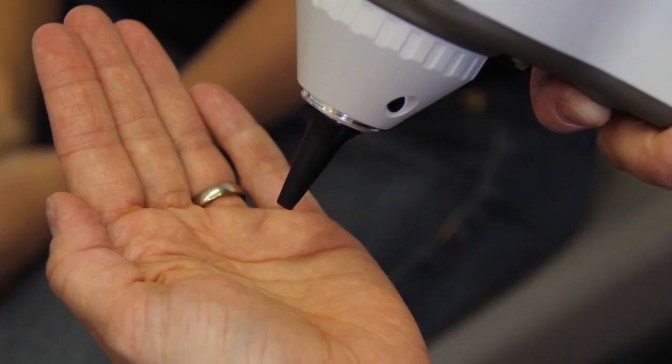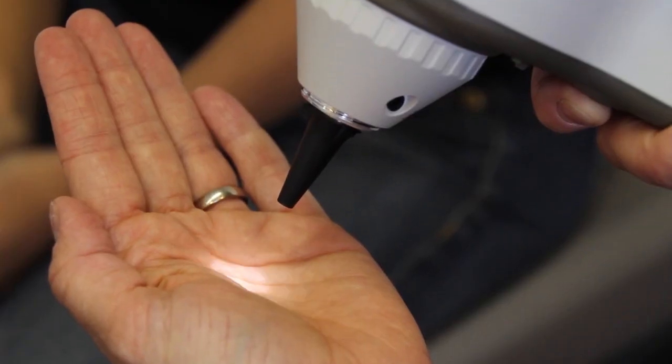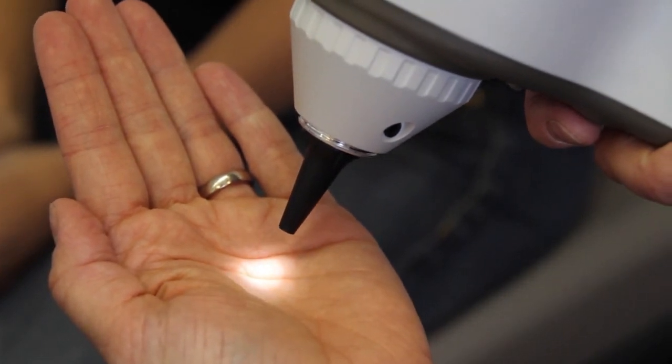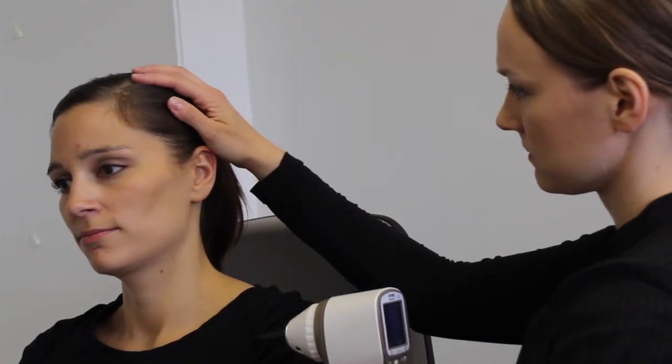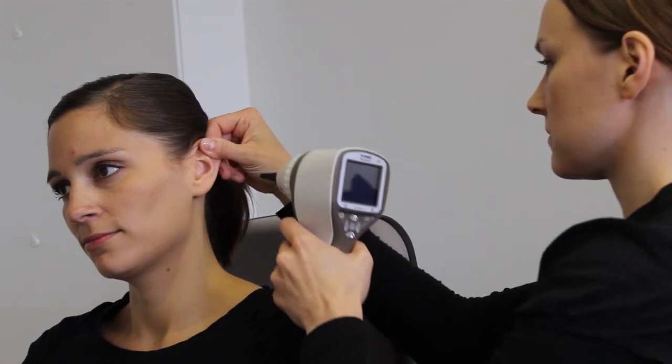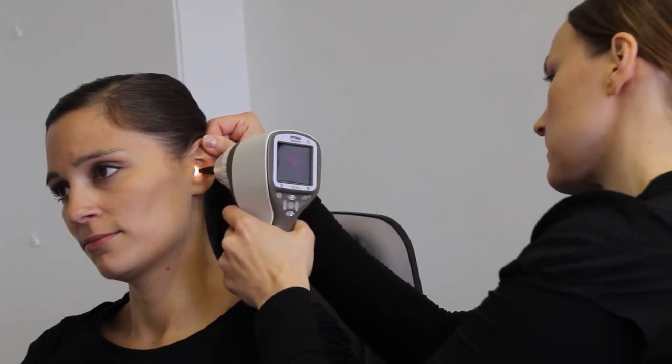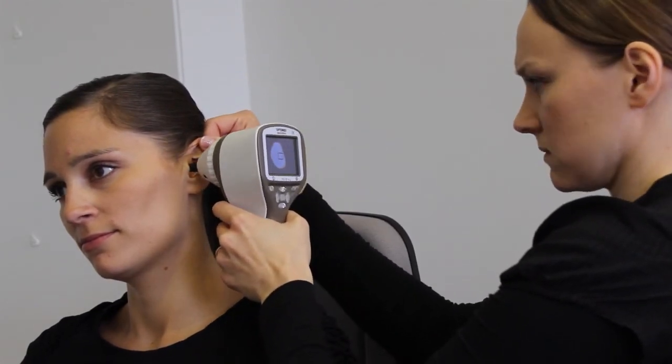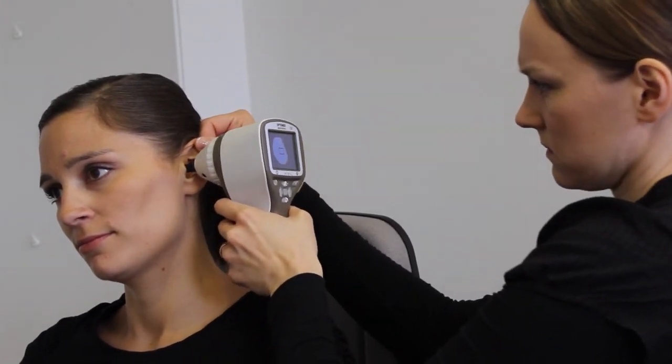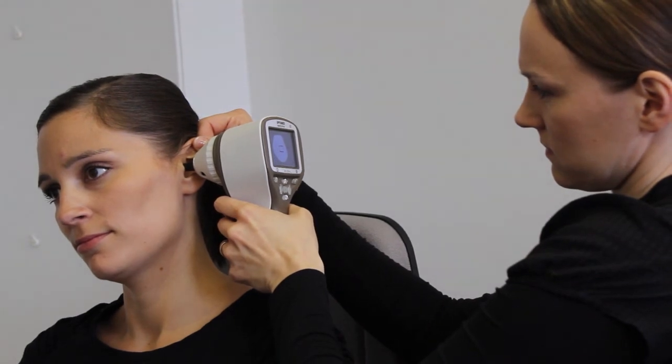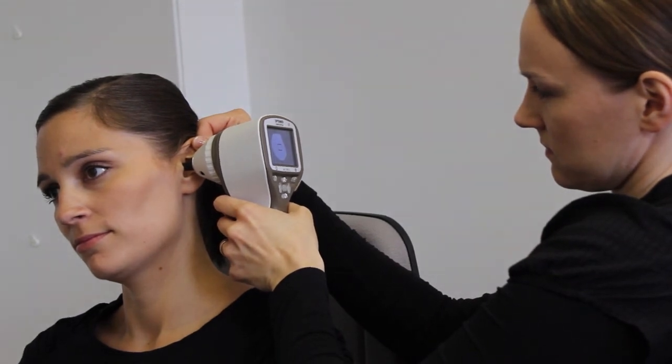Turn the light on by pressing the shutter halfway down. The patient is asked to tilt their head away from the doctor. Gently pull the ear pinna upwards and back and insert the speculum directly into the ear canal.